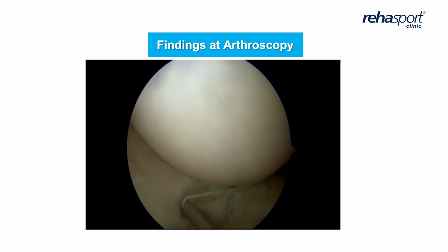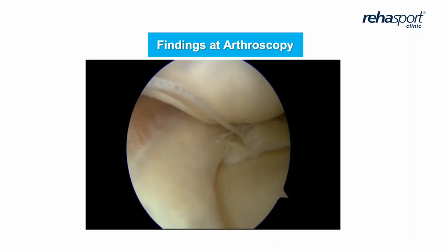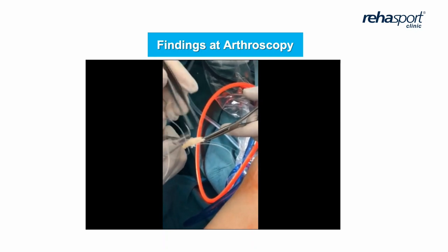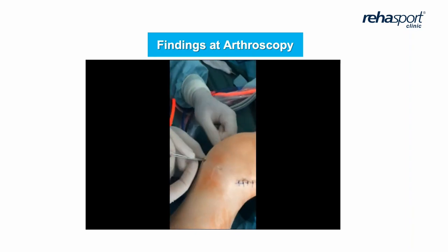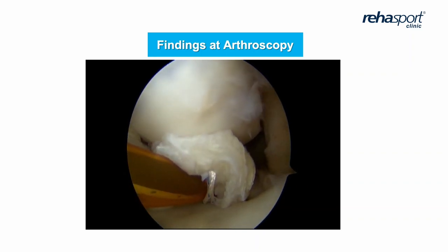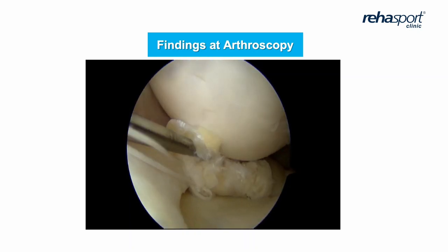If we are sure that everything is in place — here is the absence of the meniscus mass — and why we chose the Henning technique: because we would like to support healing with the fascia latae. This is the two sutures for the parachute technique. The fascia latae is stabilised at these points, then put inside the knee using the tent parachute technique. Once the fascia latae is in place, we stabilise it using the all-inside technique, and then we precisely cover the gap of the meniscus with the fascia latae using inside-out sutures.